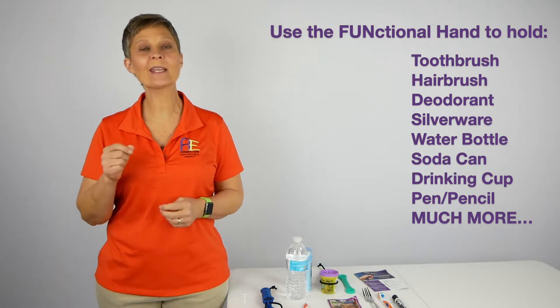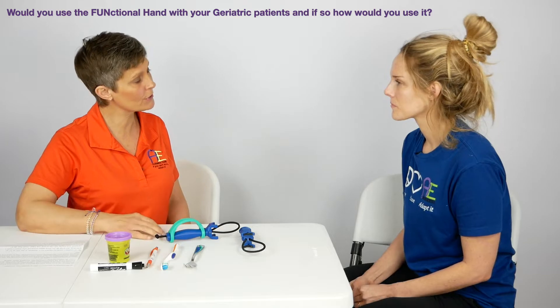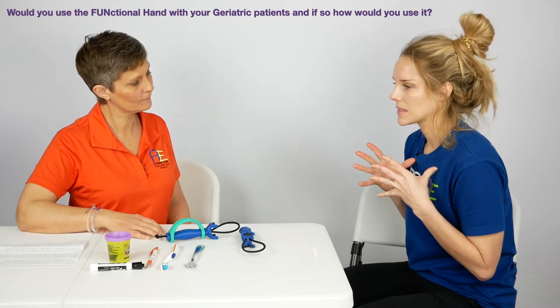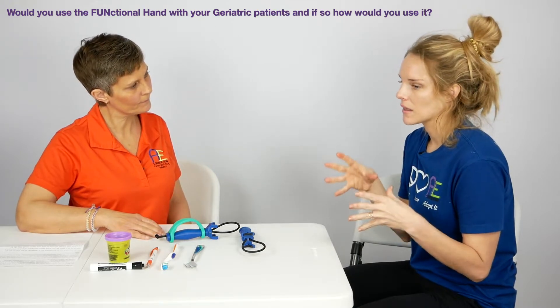Let's check in with our OT, Becca, to see what she thought about the Functional Hand. Becca, as you and I work in the geriatric population, one of our main goals is to keep our people as independently functioning as possible. Would you use this product with your clients? Absolutely. I think it's a lovely product that you can so easily add into any client or patient's typical day. Anything and everything they use to grab onto is something you can use the Functional Hand with.